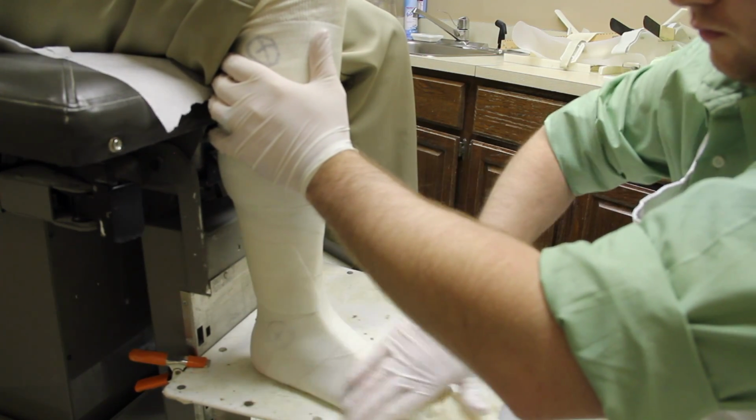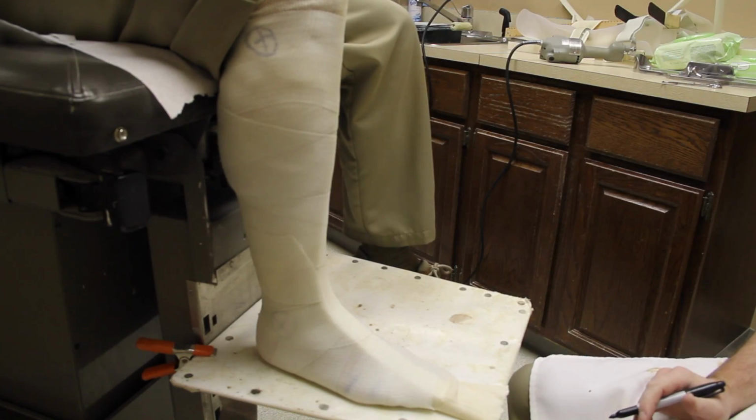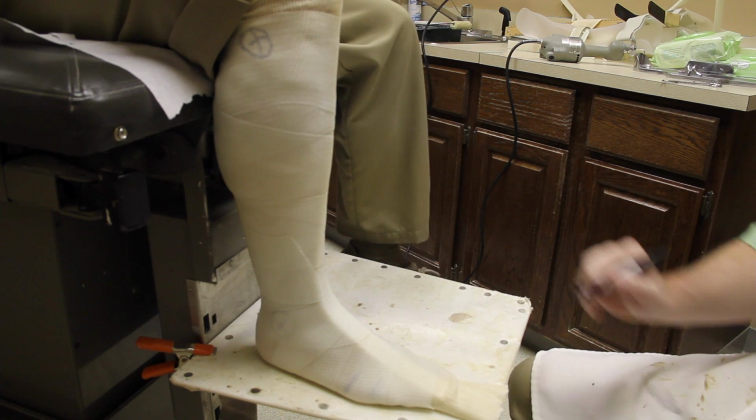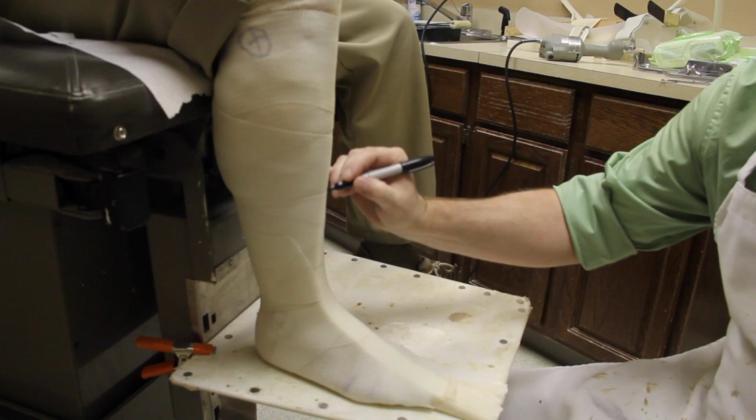Waiting for the fiberglass to set up may take about 5 minutes. Now that the fiberglass is hardened up, we'll mark a trim line to cut it apart, and that way we know how to put it back together once we cut it open with the cast saw.